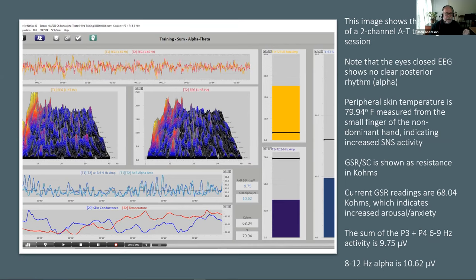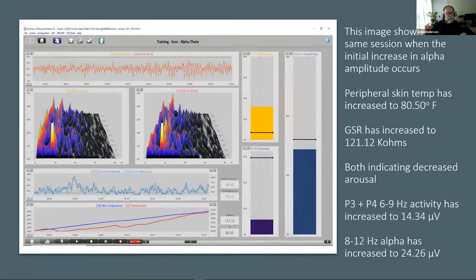So she's busy processing information. As the session progresses, she begins to produce a nice alpha response. You see that nice peak there? Now it's running a little bit slow because she's also starting to get more relaxed. So as the person becomes more relaxed and a bit drowsy, the EEG activity that is in the alpha frequency band of 8 to 12 hertz shifts away from 10 hertz and moves down towards a slower frequency. So she's really at about 8.5, 9 hertz here, which is nice.